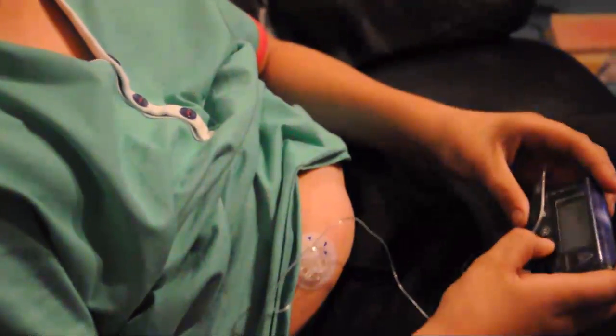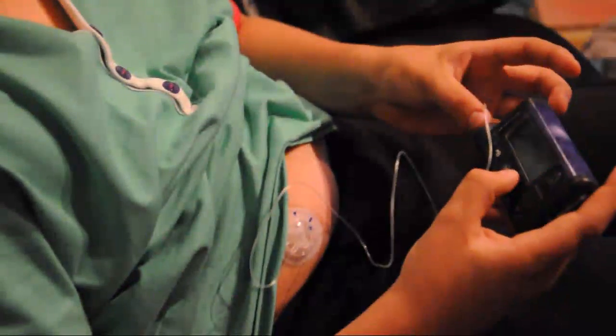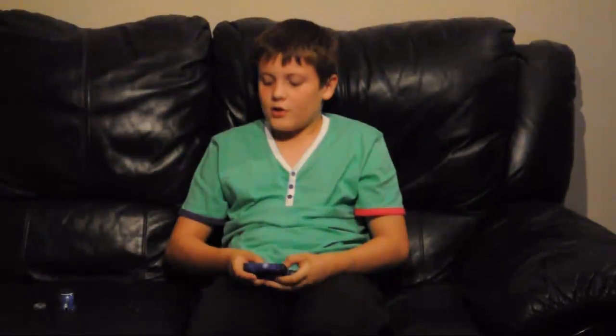So I press the act button, I need to fill it because the insulin will have gone through the needle instead of going through the plastic cannula which stays in my body. So I just press act, fills that, and it fills with 0.3 units. That was preset because the infusion set is 6 millimeters long, and that stays in. Now I'm good to go.